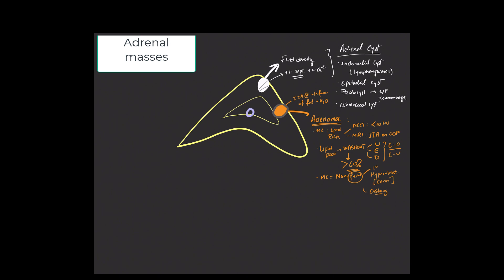Next, we have a relatively uncommon lesion that arises from the adrenal medulla, as can be seen here. And this is going to be the pheochromocytoma. The characteristic imaging features that we look for are on MR imaging, light bulb bright T2 signal. That's not always seen, but that has been the characteristic feature that has been described. But more often, we see a mass that's really hypervascular. Often, they'll have some degree of both, with the overall appearance tend to be somewhat heterogeneous, due to internal necrosis or hemorrhage. And on occasion, you can see a salt and pepper appearance within the lesion itself. Those instances, the salt portion is the hypervascular portion of the mass, whereas the pepper is some of the flow voids that can be seen in these lesions.